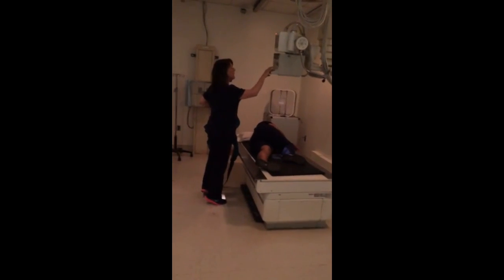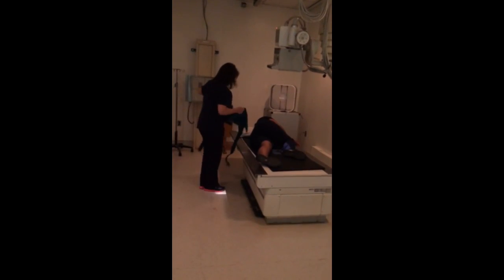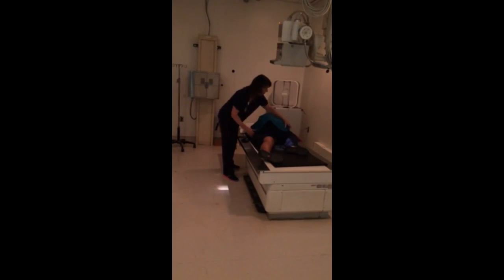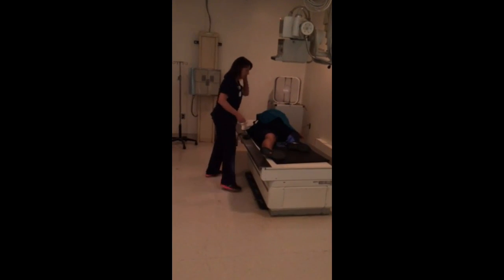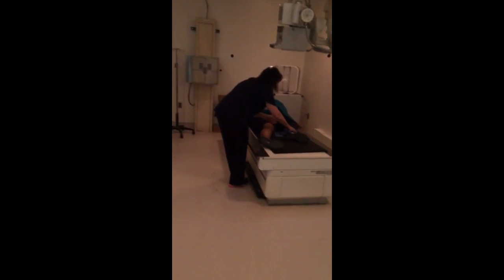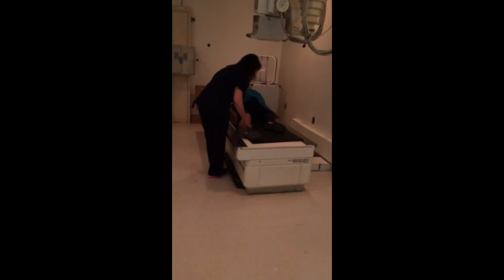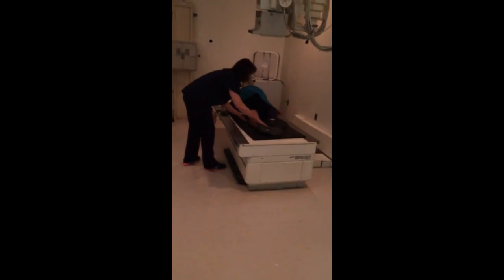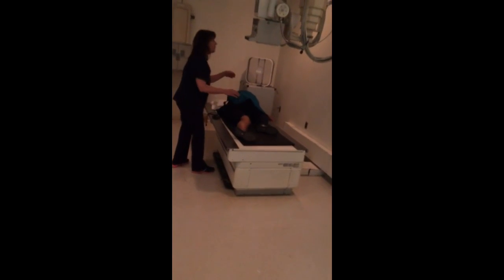Change that slightly. I'm going to re-put the shield on her. I'm going to have her take her top leg over like she has it. I'm going to have her shift her leg forward, and I'm going to have her bottom leg, her affected leg, bent 20 to 30 degrees.